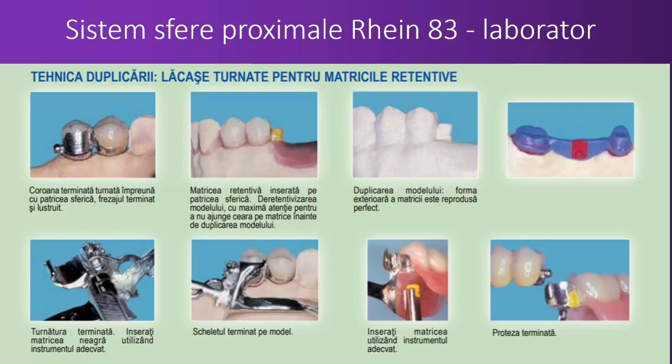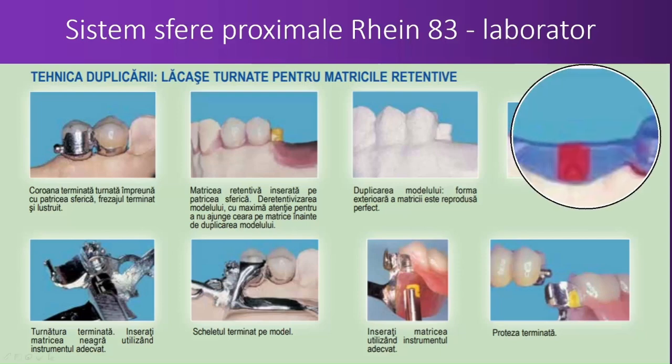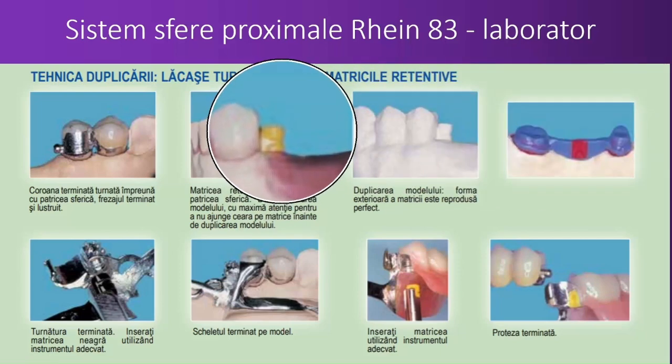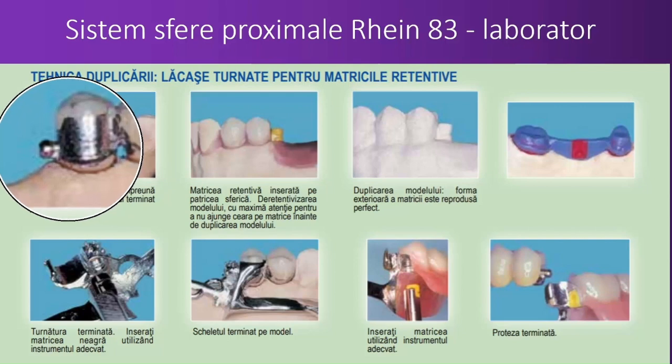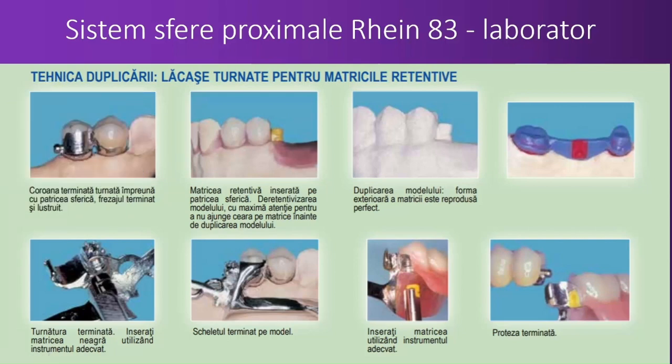So they were quite widely used at that time, 2006, 7, 2008, 2010, and then people moved to implants after all, right? But those spheres or ball attachments are still used to this day. They are slowly replaced by other systems, locators, magnets. Locators seem to be a little bit better. Anyhow, those spheres are mostly used now as occlusal systems, or attachments, not on the proximal, but as we have seen before, after cutting the root, they sit on top of the remaining root, right?